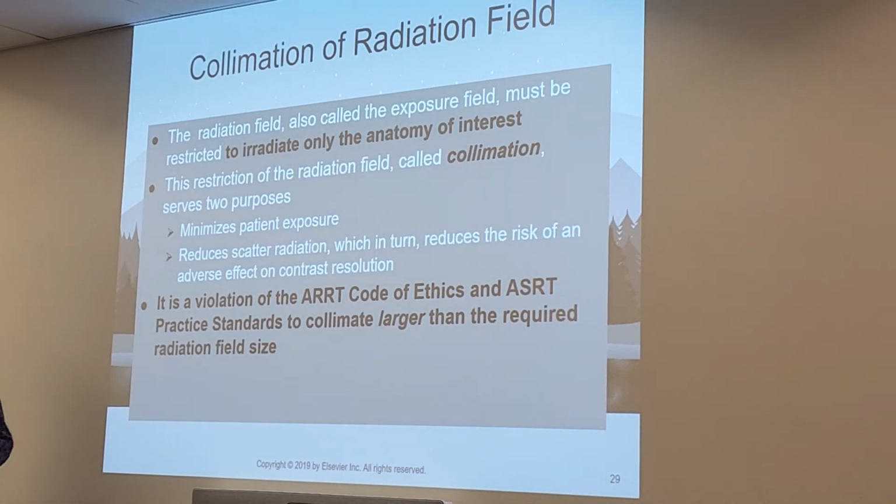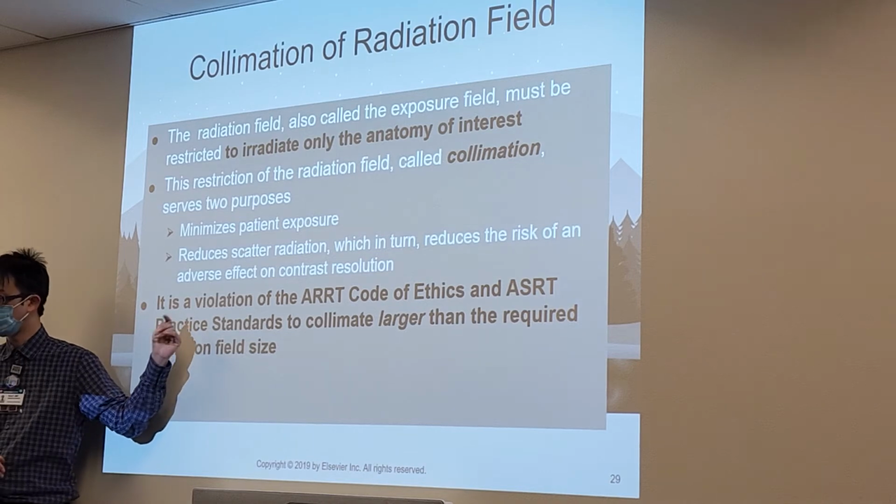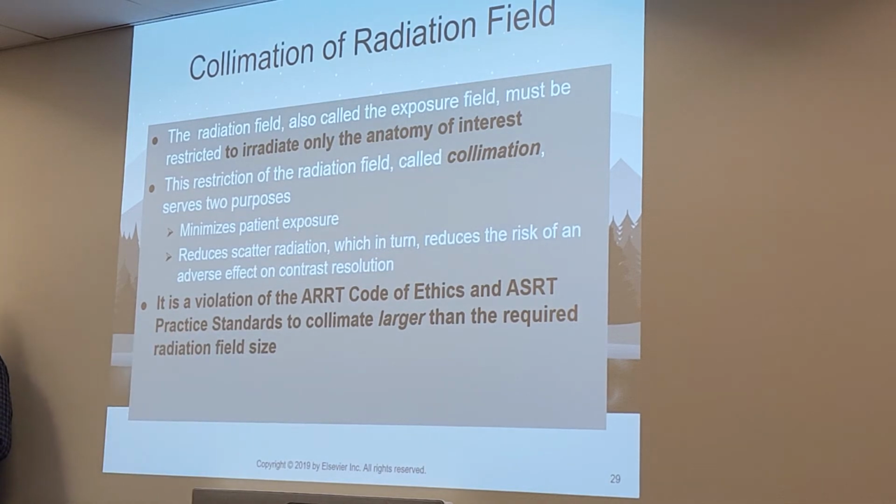It is a violation of the ASRT practice standards to collimate larger than the required radiation field size.